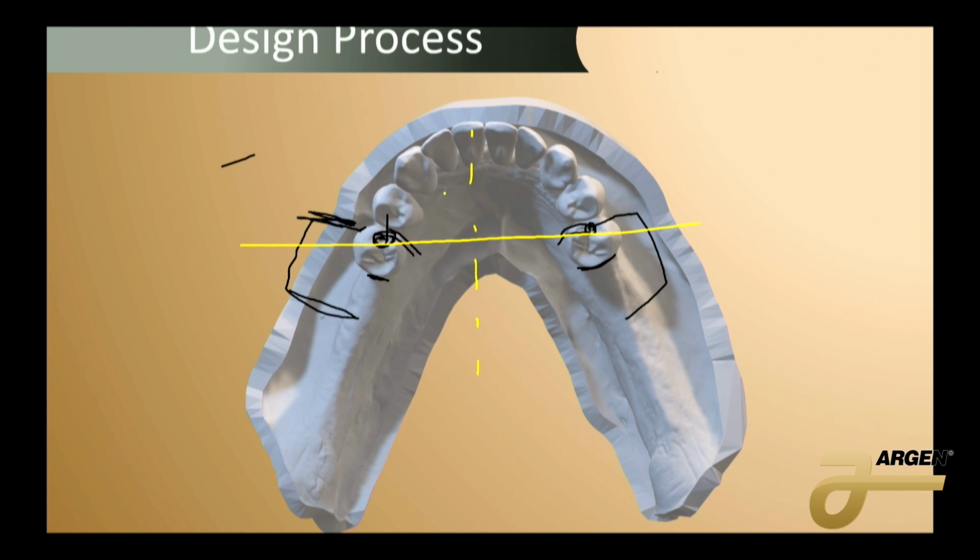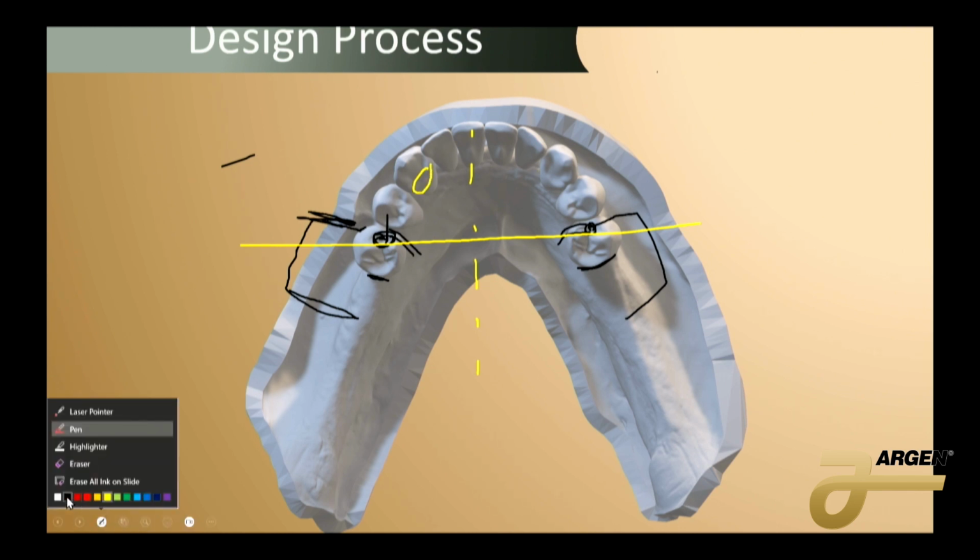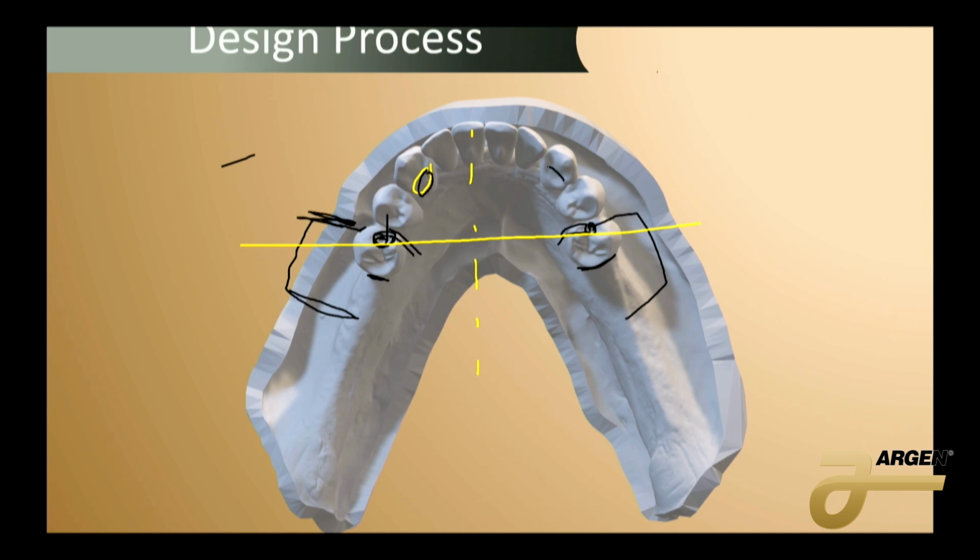It's a wider tooth, it's rooted into the bone a little deeper. If you don't have the occlusal space, a cingulum rest is always good too. So let's say for this one we have a cingulum rest, so we'll do a rest here. We'll go back to our black marker actually. We'll do a rest here. We'll do a rest here. And now we have our fulcrum reciprocated, right?